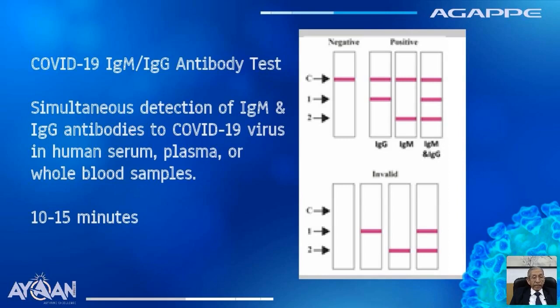Now, we can say that the strips are there, blotting paper-like strips. In the uppermost area, we put the blood sample or plasma or serum, and then add the reagent. The reagent will be available in the kit, and then that will be absorbed. And after some time, all the necessary anti-IgG antibodies, etc., will be already there in that particular blotting paper. And therefore, after 15 minutes, you will get such a result.